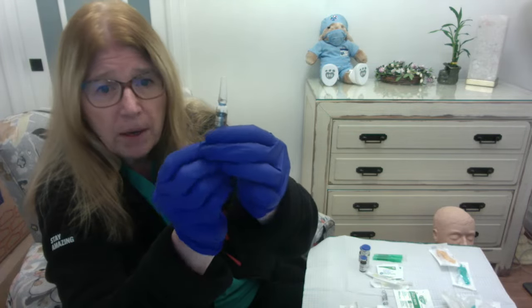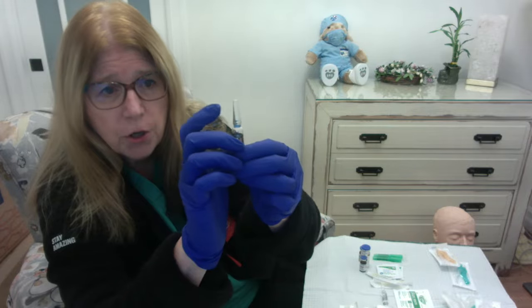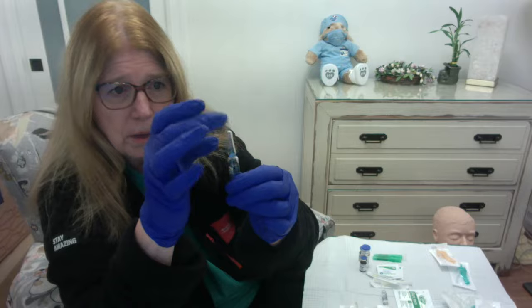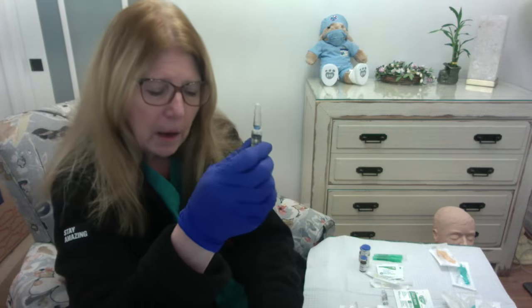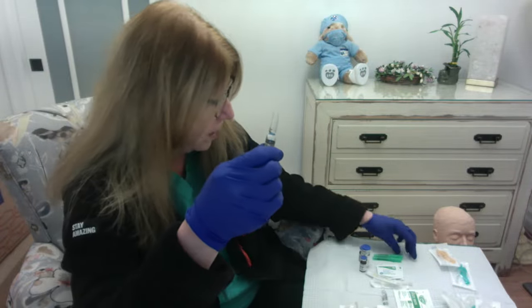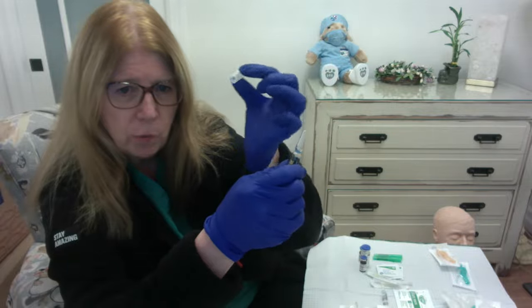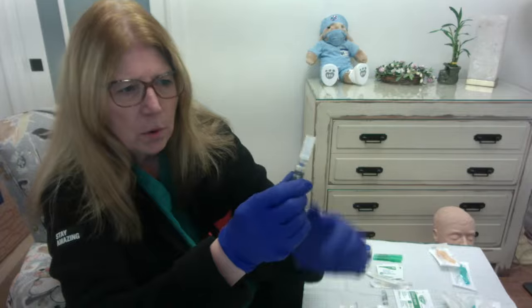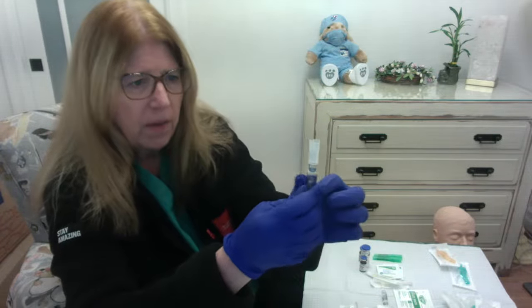Now, one thing you have to make sure of is that all of your medicine from the top portion of the ampule is down into the bottom portion, okay? So you can give the top a little bit of a flick. I'm going to show you how to open the ampule in two different ways. One would be using something that we call an ampule breaker, and that's what this little thing looks like. So you fit the ampule breaker onto the top of the ampule.